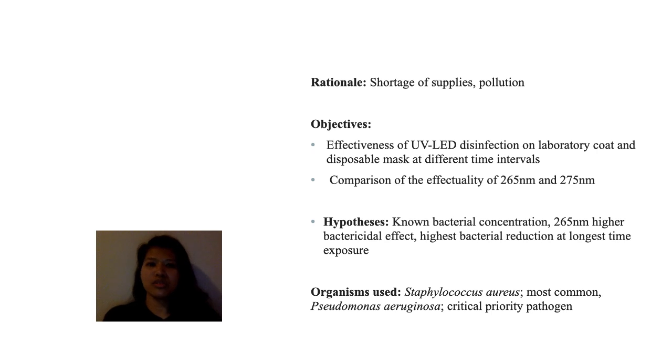The researchers chose the organisms Staphylococcus aureus as it is the most common skin bacteria, and Pseudomonas aeruginosa as it was listed by the World Health Organization as a critical priority pathogen for research and development.